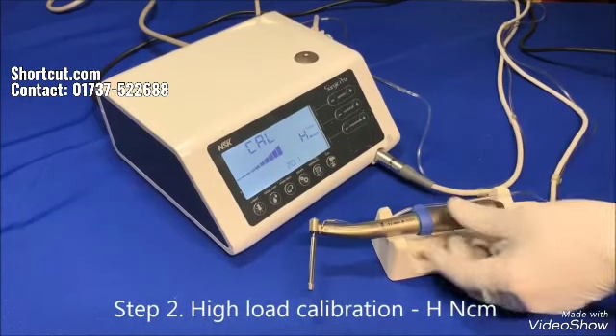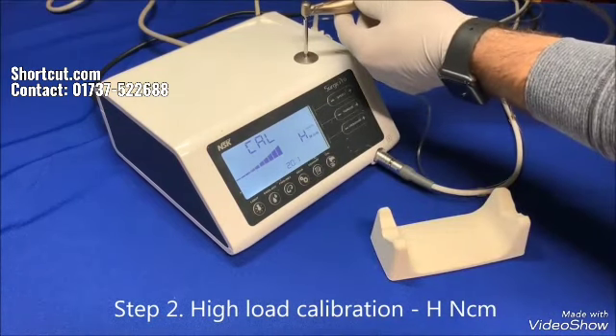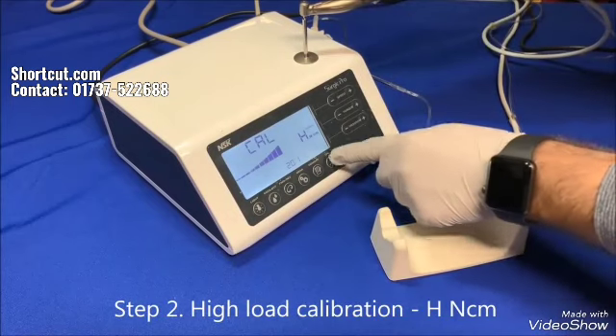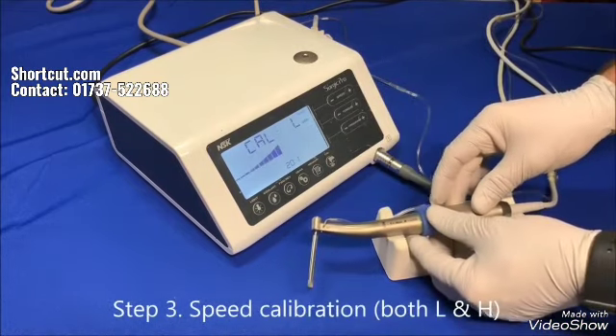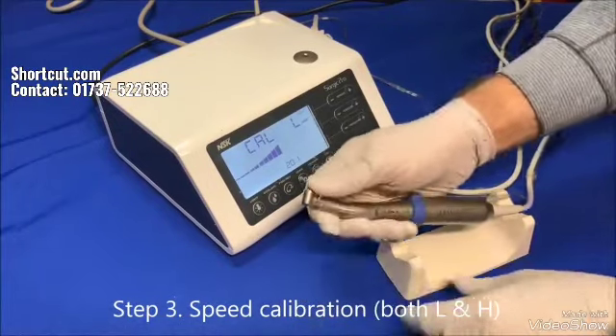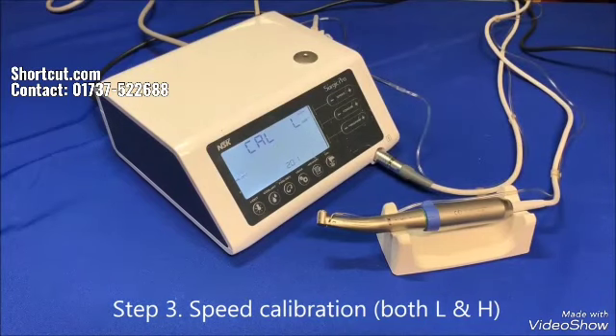For load calibration, the torque display shows H. Insert the hexagon head of the drill into the calibration block. Hold the motor tightly so it won't move left or right. Press calibration. The drill will begin to rotate the round block rather heavily. Once this part is completed, there will be a beep sound and done will be displayed. For speed calibration, remove the drill and leave the motor and the handpiece on the handpiece stand. Press the calibration button — the attachment will start working and rotate with no drill. It runs 8 seconds in slow, then another 8 seconds in fast speed. Once this part is completed, there will be a beep sound — that's when the entire process is completed.